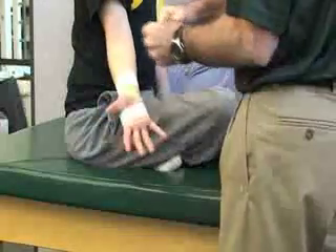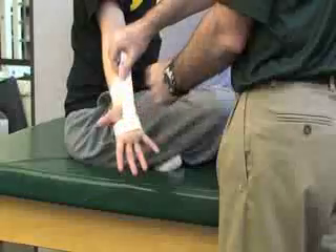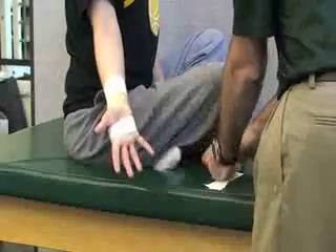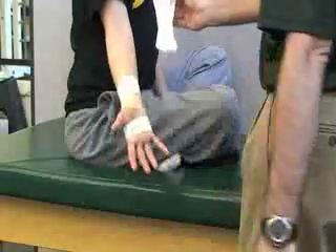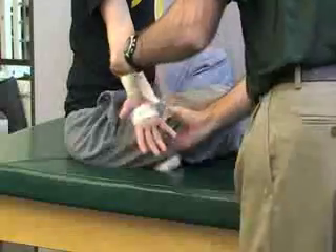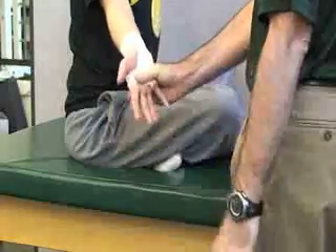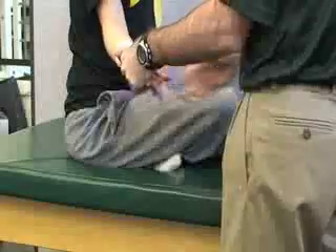To also prevent hyperextension, apply an X pattern on the palmar side. Measure from the top to bottom, rip and make another X pattern just like we did on the dorsal side. Attach this on the forearm first. If it's not providing enough support, shorten it. Test it before attaching — have her hyperextend to check effectiveness.